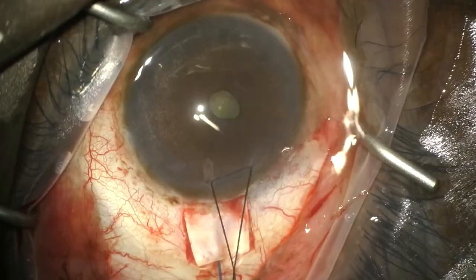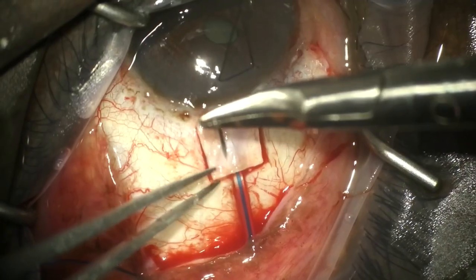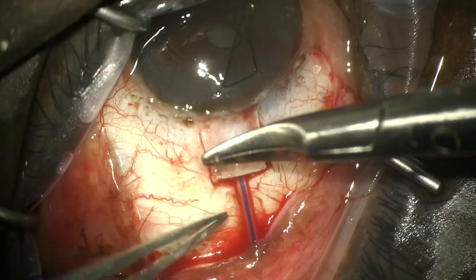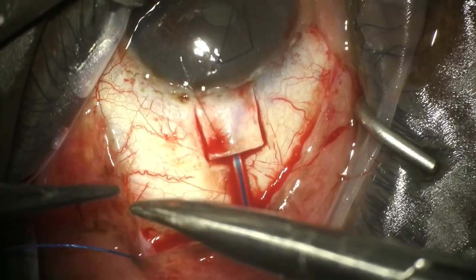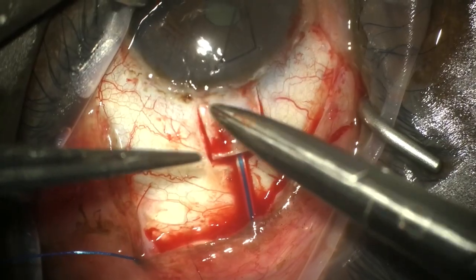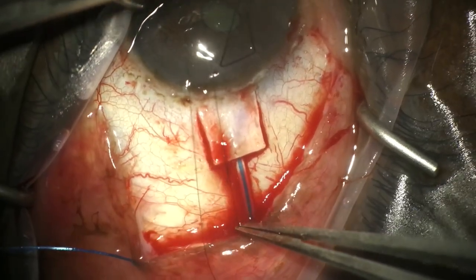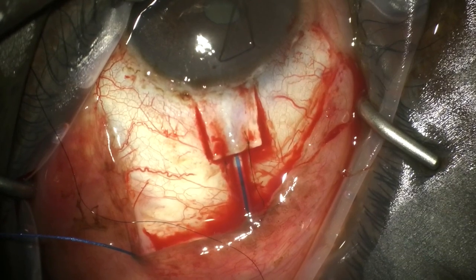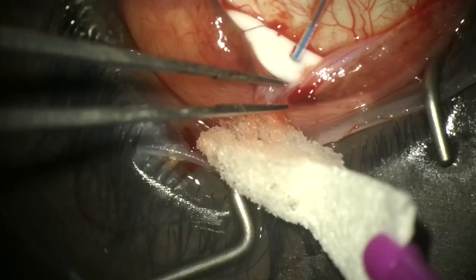We check the tube and it looks in a very satisfactory position. We then suture down the autologous flap created from the patient's native sclera to ensure the tube is secured under it — this requires around two sutures either side of the tube and then two either side on the flap.